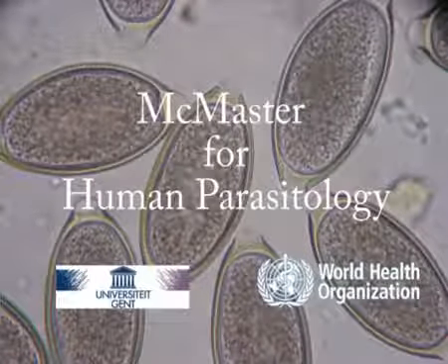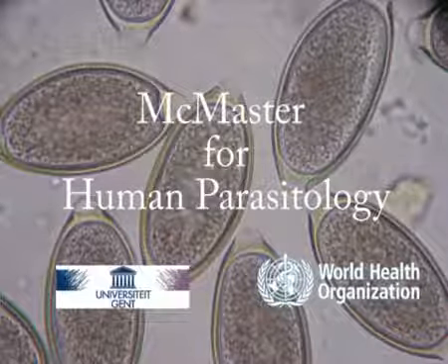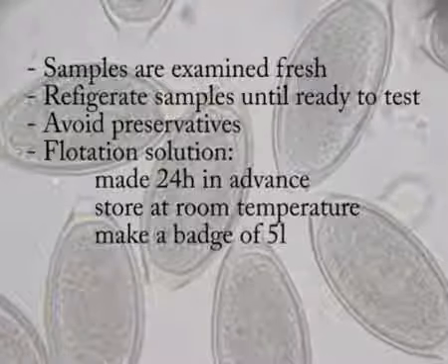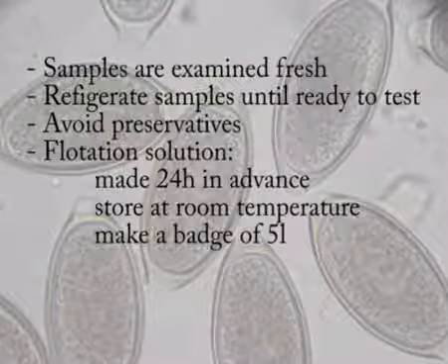McMaster for human parasitology. General information. Preferably, the fecal samples are examined fresh.